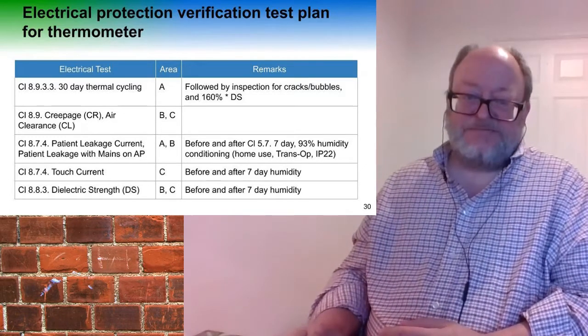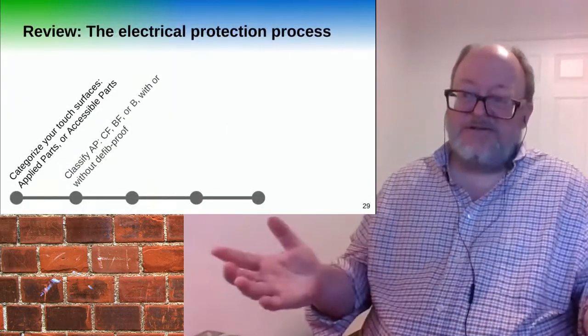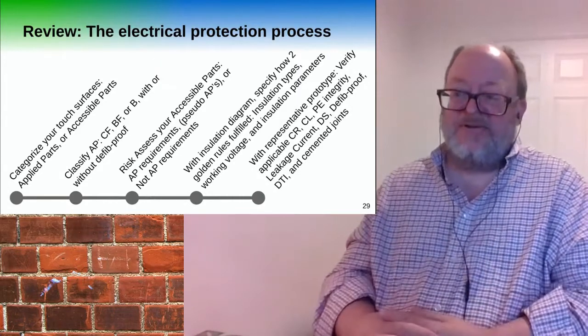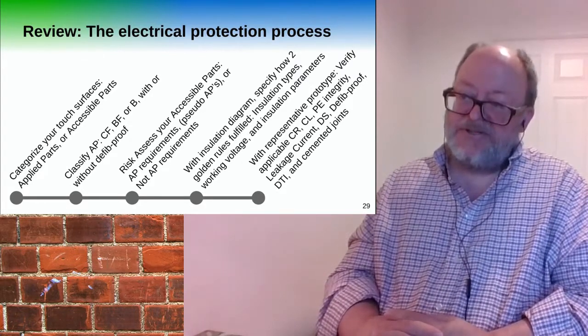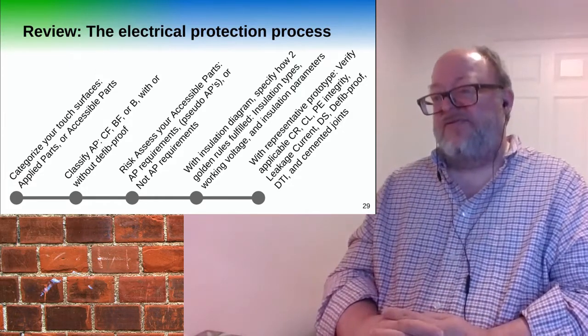All right, so for review: categorize your touch surfaces, classify the applied part, risk assess your accessible parts, MOOP, put your insulation diagram together, look up your insulation parameters, and then your test program follows from that.